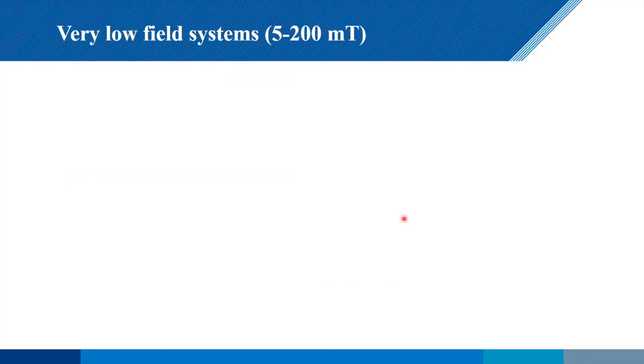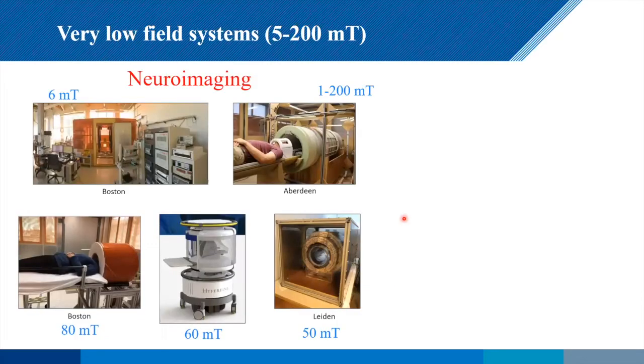So very low field systems, you know most of these, right? I think Matt's system over there was really the one that when we started thinking about this gave us confidence, or a degree of confidence, that this was not going to be a wild goose chase, right? If you go 6 millitesla and you can get those amazing images still from Mathieu Sarracanie, back in 2015 or whatever, they're still amazing to look at, thinking this comes from 6 millitesla.